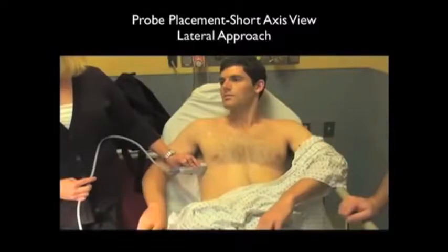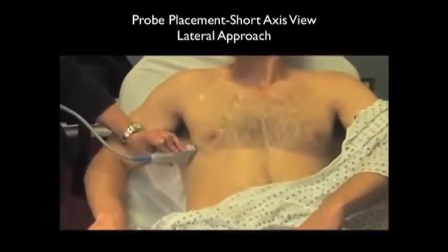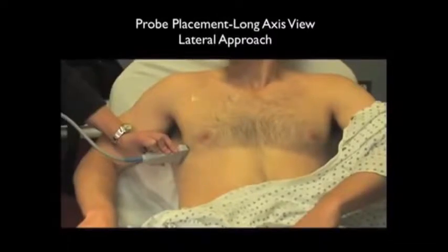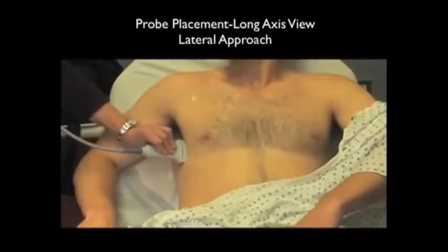If no lung is seen on the anterior chest wall, one can size out a pneumothorax by looking in the lateral positions as shown here. Notice the probe on the lateral chest wall in the short axis configuration between the ribs. If lung is seen here laterally, but not anteriorly, this would tell you it was an incomplete pneumothorax. We can complement the short axis view by locating the probe into the long axis configuration with the marker dot towards the patient's axilla to further examine these lateral areas of the chest wall.